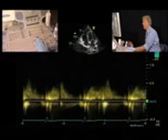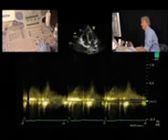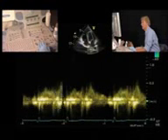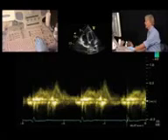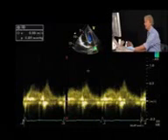And then you have a signal like this, where you should also bring down the filter, because if you have a high filter, you will not see anything. So bring down the filter so that you even see the low velocities. And usually the patient breathes and the signal is gone. Okay, but this would be the signal now. What you see here is the typical systolic component, the diastolic component, and the retrograde component of pulmonic venous flow.